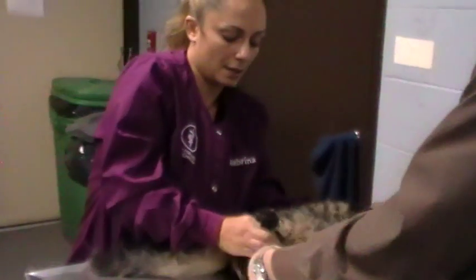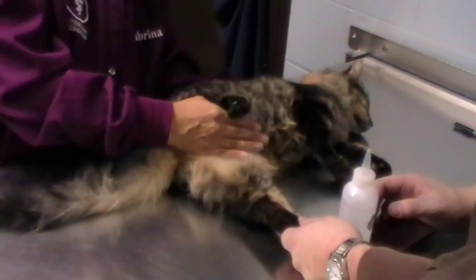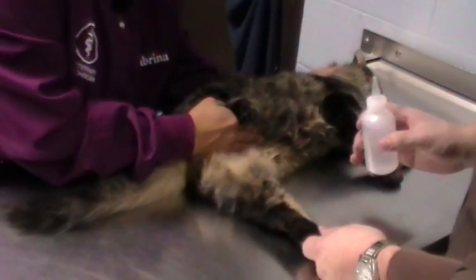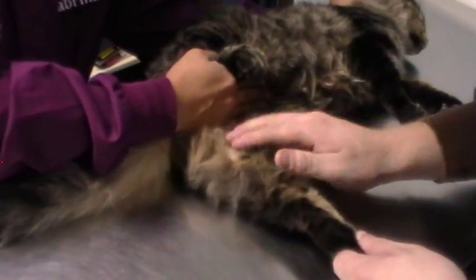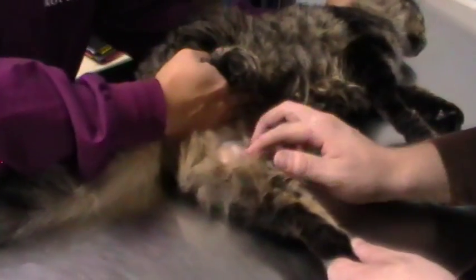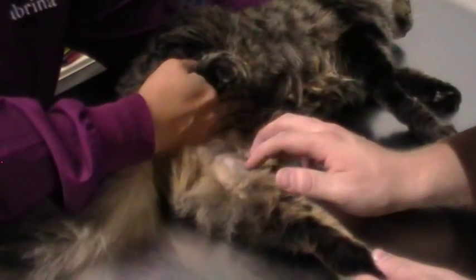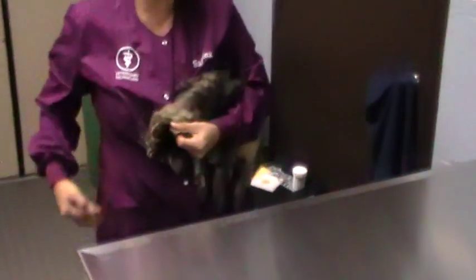Now I'm going to occlude the medial femoral. I bring my hand up — I'm still holding her right leg, pulling it to her body. TJ is pulling her leg out, and I'm going to occlude that vessel by applying pressure. He's going to put a little bit of alcohol on, just like he'd be getting ready to draw blood from this vessel. There's nothing I can do about her front legs, so TJ is being very careful. If you can see in there, the vessel is up because of the occlusion — right there. Now I'm going to release her, so TJ lets go, grab her abdomen, and put her back on my hip.